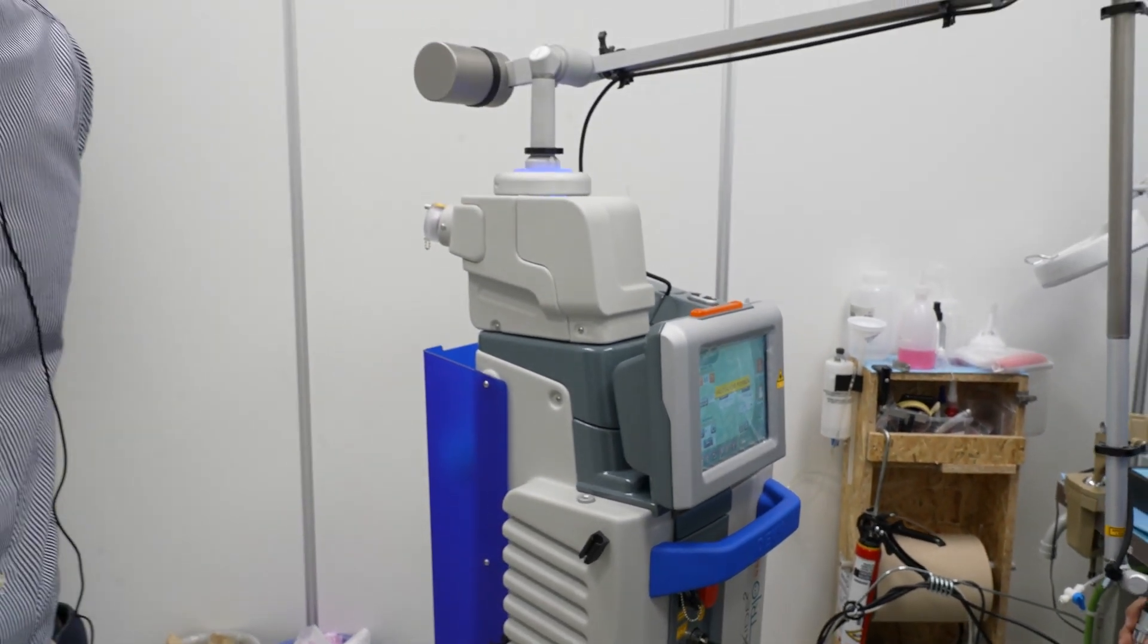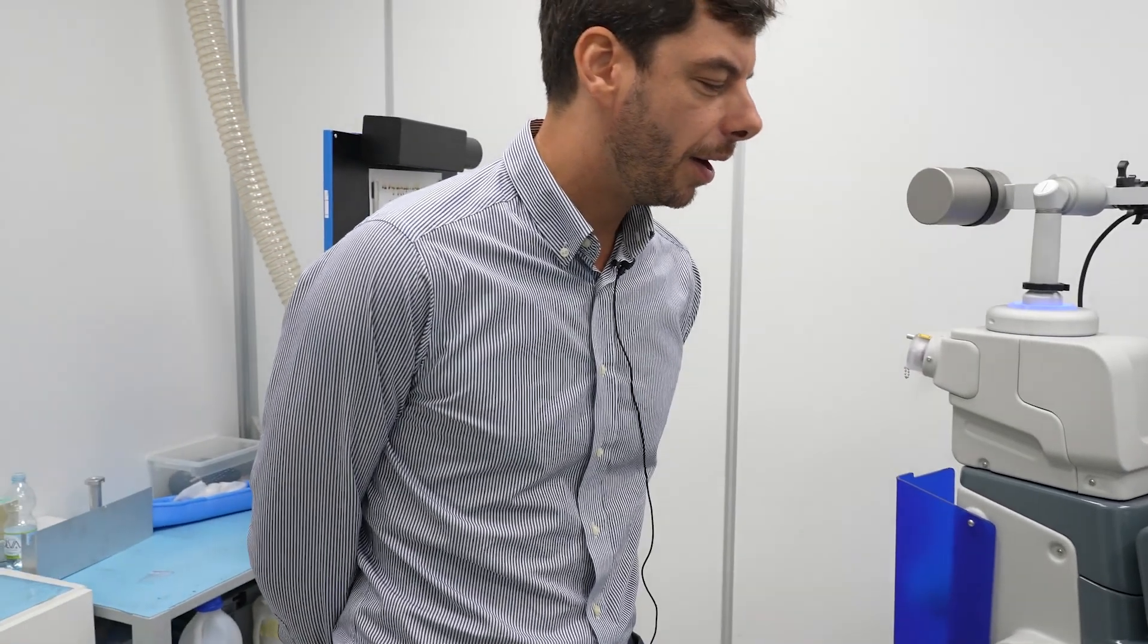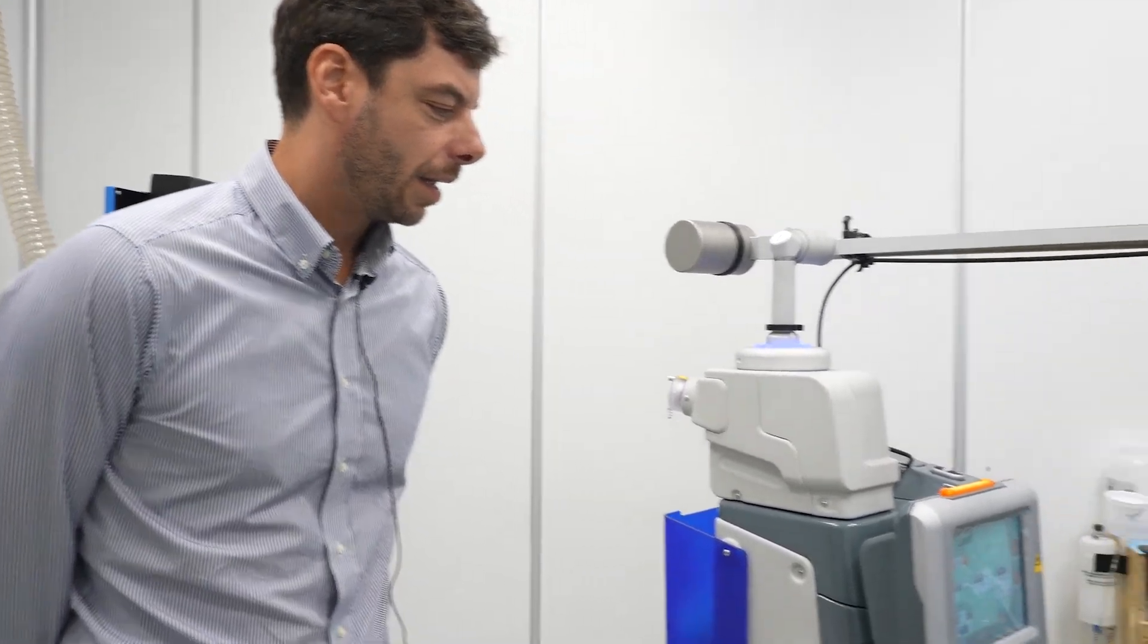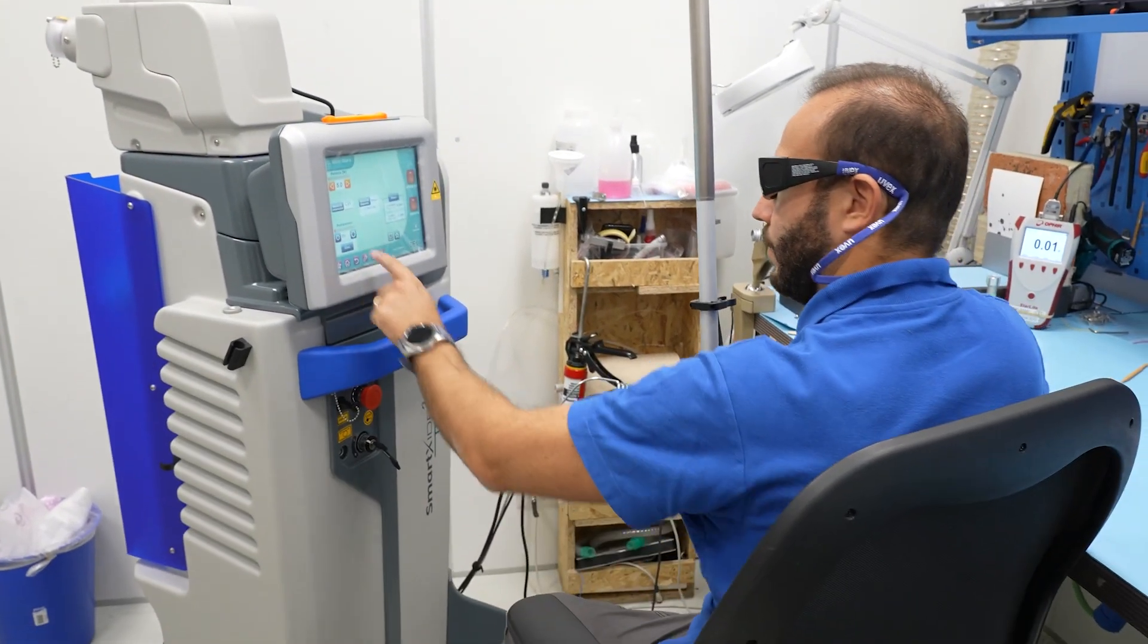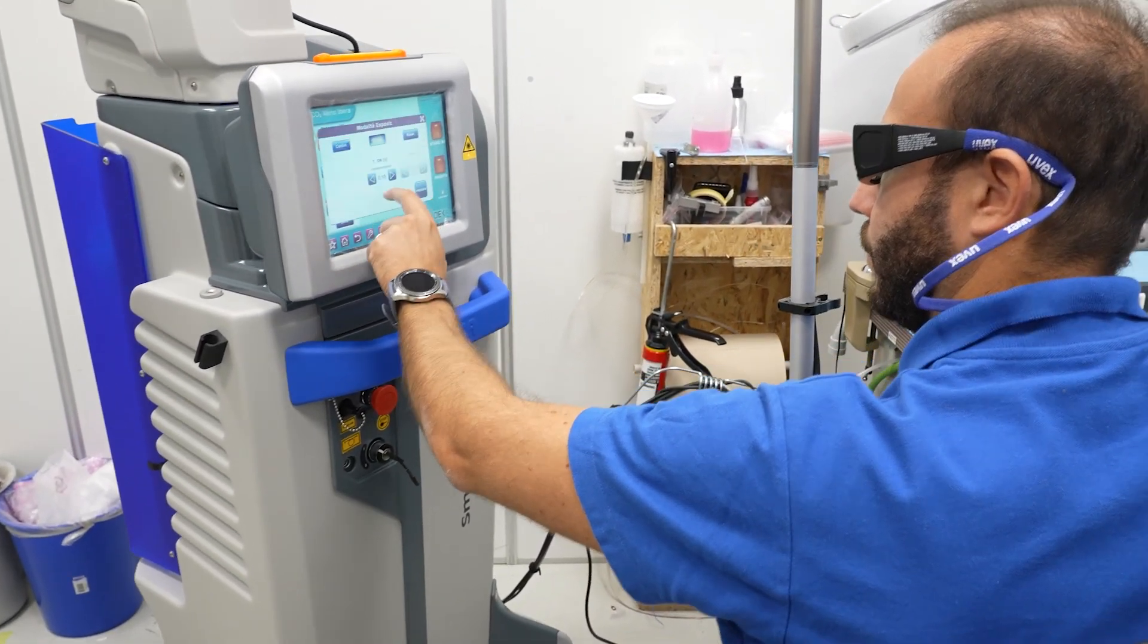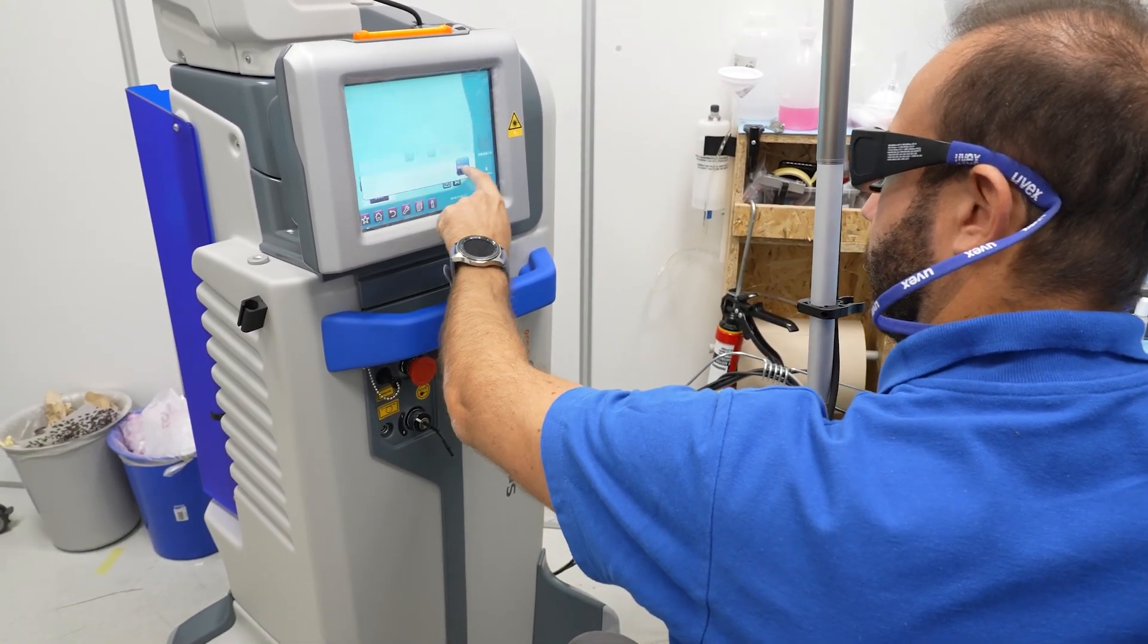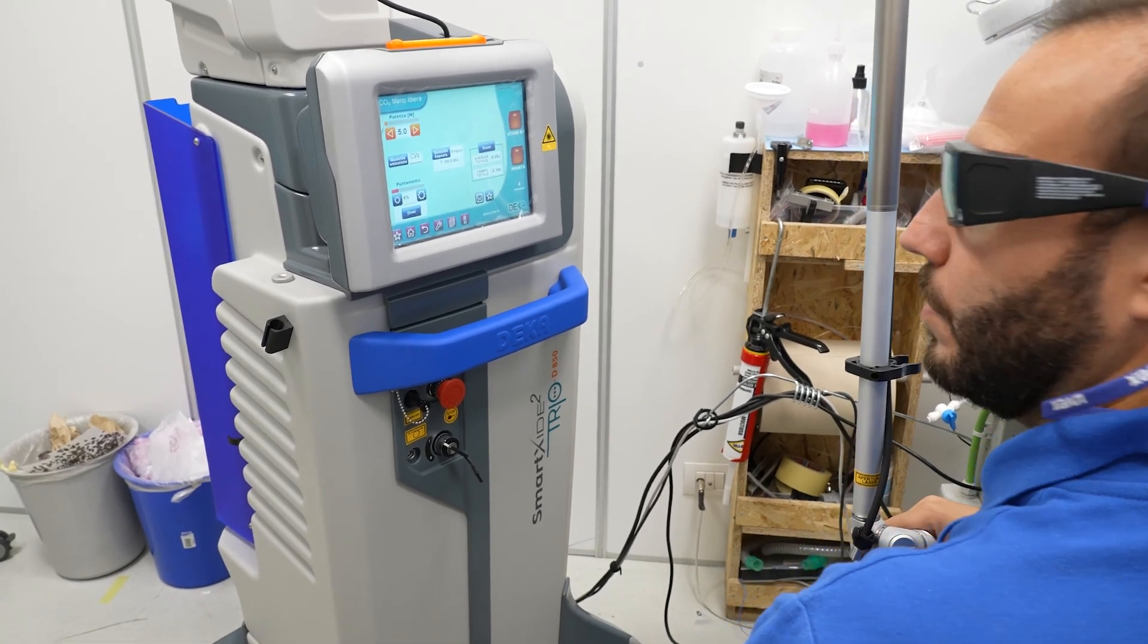We are in the box with Lorenzo. Lorenzo Tempestini is our senior person in charge of line one of CO2 lasers, and in this box we test each CO2 laser and also SmartXide² Trio.